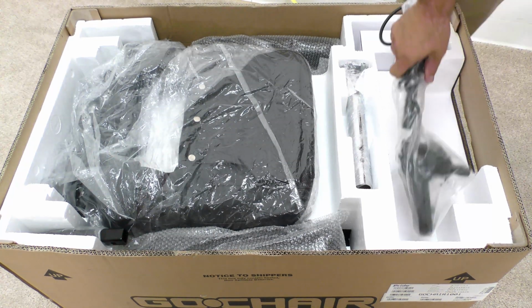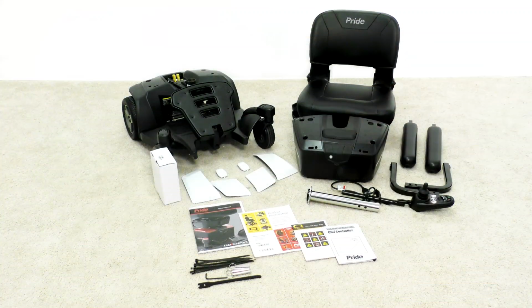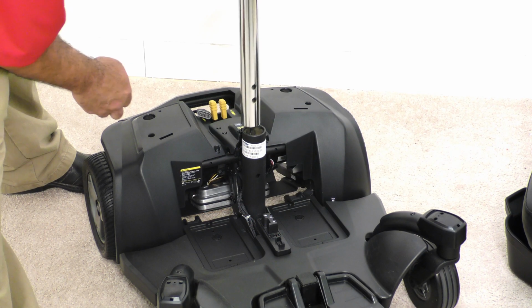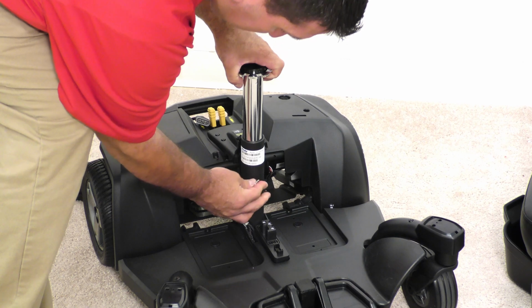Once you have removed all of the components of the Go chair from the carton, you are ready to assemble the unit. Your owner's packet will contain the detent pins for the seat post, armrests, accessory receiver tube, 4mm Allen wrench, and wire ties for the harness securement. Begin by setting the seat post to the desired height and attaching it with the larger detent pin.